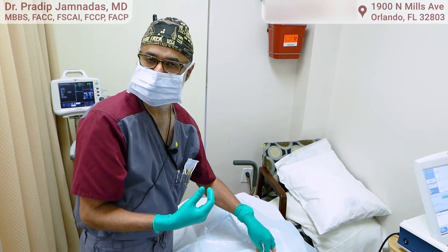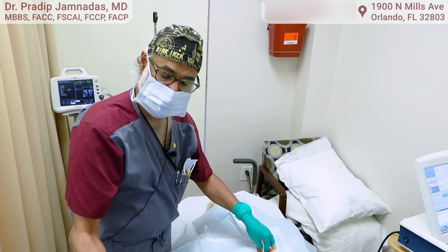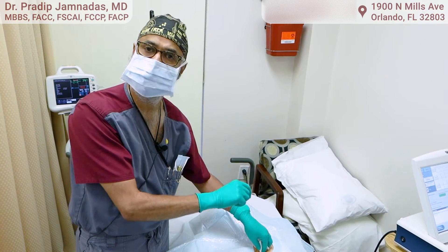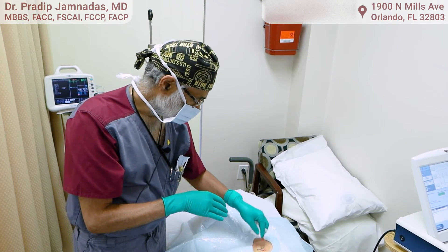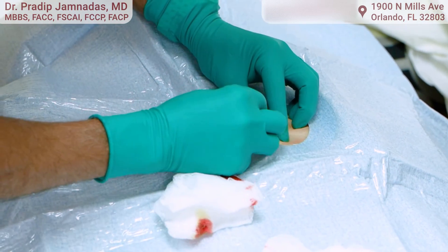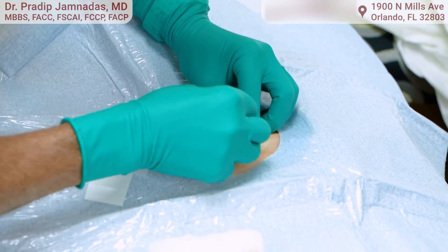To take this device out, it's just the opposite — I make a small incision with my blade, then use a little set of forceps to grab hold of it and pull it right up. Even taking it out takes literally five minutes, and putting it in takes five minutes. Once it's in, the patient won't even know they have it. I'm going to put the steri-strips on — I grab the skin on either side and bring it together.